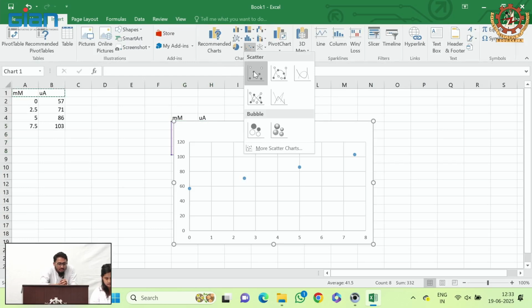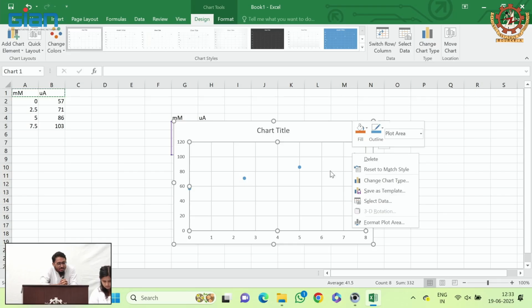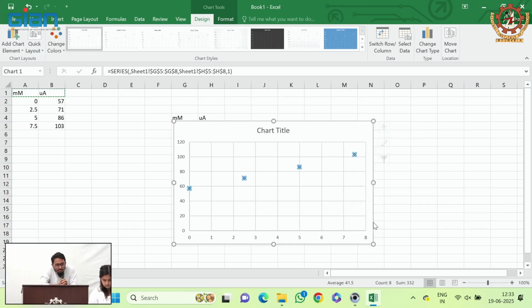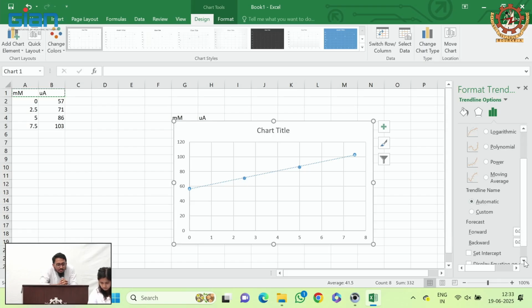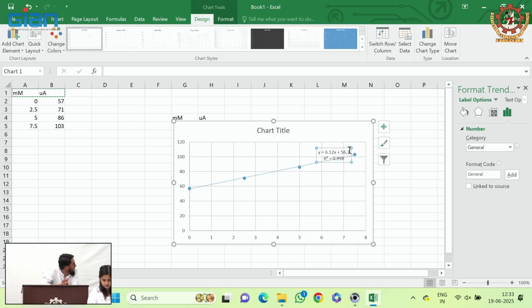Let's have a look at the linear fit. Oh, nice. Looks like a very good linear fit. We can look at the R square value and the sensitivity. Linear fit, please. Linear fit, done. R square is how much? 0.99. Okay, done. What is the sensitivity? 6.12 microamps per millimolar. 6.12.